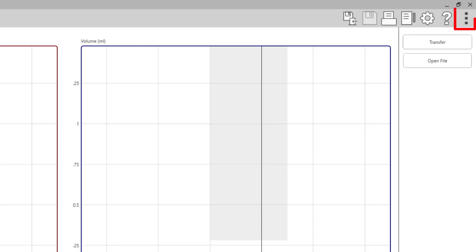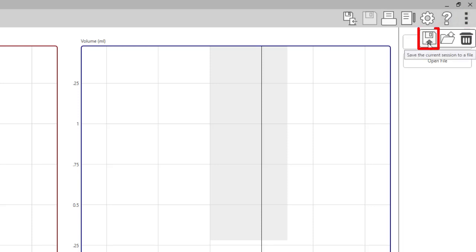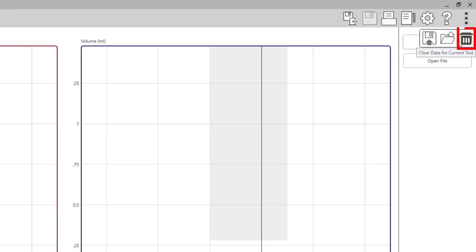The last icon is the more icon. From here you can save the current session or open a session from a file. You can clear previous data for the current test. The old session or test will be saved in the previous session. You are simply clearing the screen for the current test.